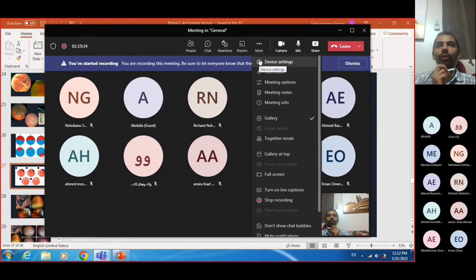Usually we depend on the OCT. If there is evidence of intraretinal or subretinal fluid, this is taken as an indication of activity of the CNV. Other clues will include the vision of the patient. In AMD clinics, they will do what we call the ETDRS letters, and they will count how many letters the patient can see, which translates to the visual acuity with Snellen's or whatever chart you use.